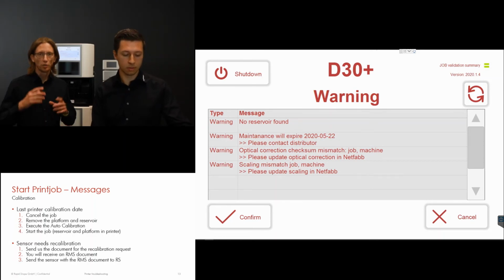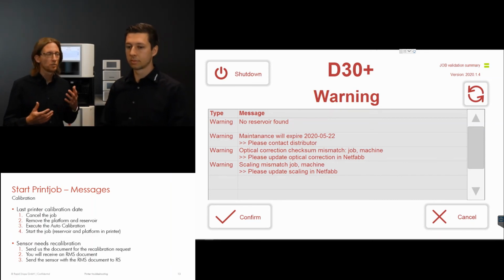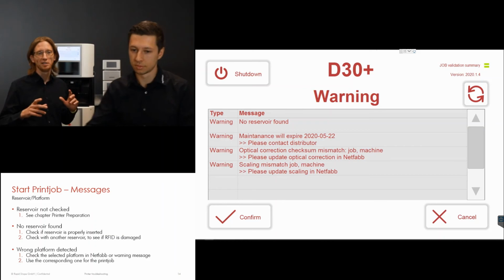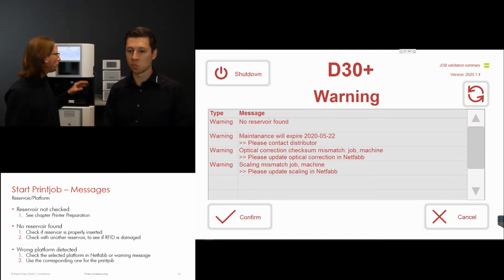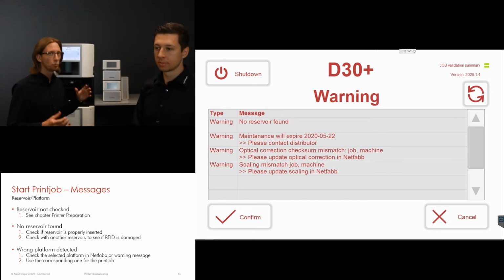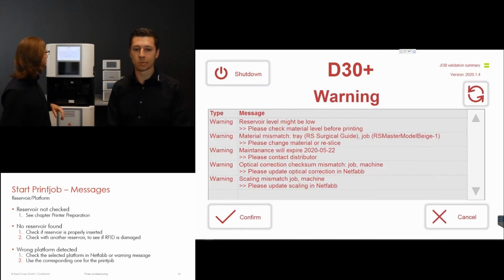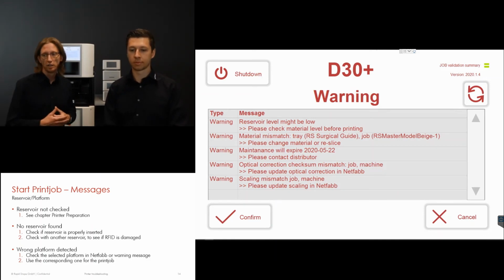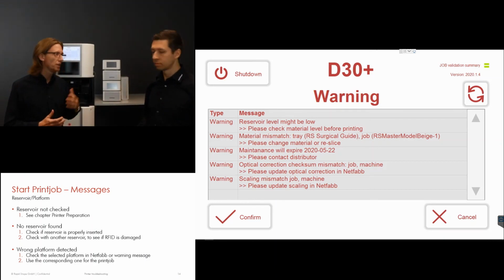Yes. Maybe one thing I would like to add: as you can see, we had the warning messages that no reservoir is found. As you can see, I did it in the background actually. I inserted a reservoir and I confirmed the reservoir messages. And now we are back at the warning screen and we still have the same message. There's something I would like to share with you, and this is the refresh button. On the top right corner you can see the refresh button, and by just clicking this it is rechecking. Now you can see it has recognized the reservoir. We get other messages now, but this is something you definitely have to press if you made some change, just to get an update about the latest messages here.